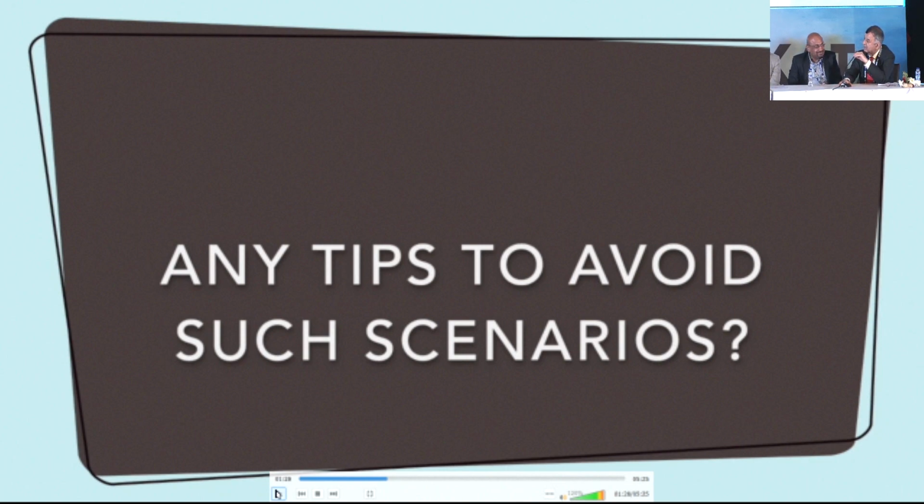Then I would advise to close the eye at this time, because otherwise it's going to become total and kissing, which is a problem. If it is limited, it will go away on its own and you can implant the lens later. Because closing the eye fastest is the best way. That is what happens. Parikshit.